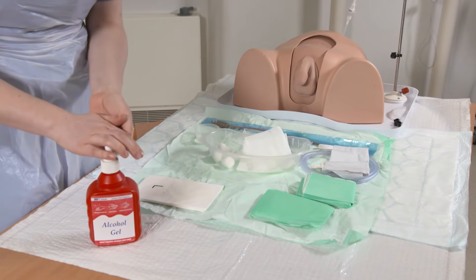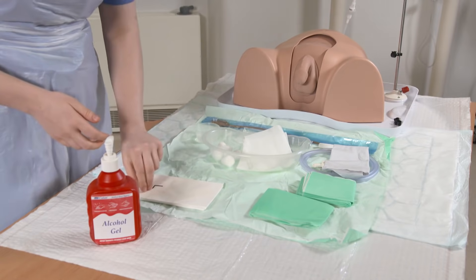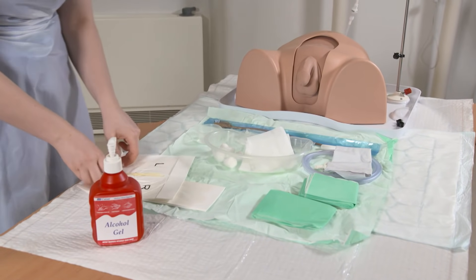The first thing I'm going to do is wash my hands with alcohol gel to start with, and then I'm going to put on my first pair of sterile gloves.